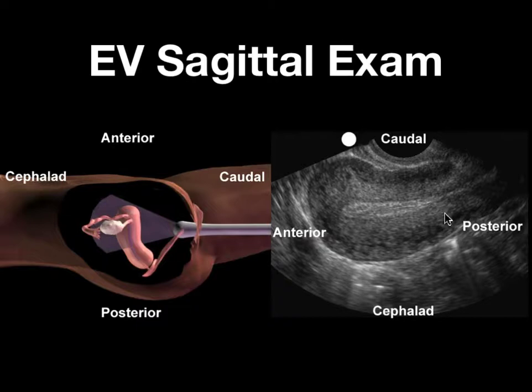I always recommend, regardless of how early you think the patient is, start off with the transabdominal exam. Since you're using a lower frequency transducer, you're going to get a broader view of the pelvic anatomy. It's possible with this high frequency coned in image here that you could miss pathology. So remember, don't use the one exam in exclusion of the other.